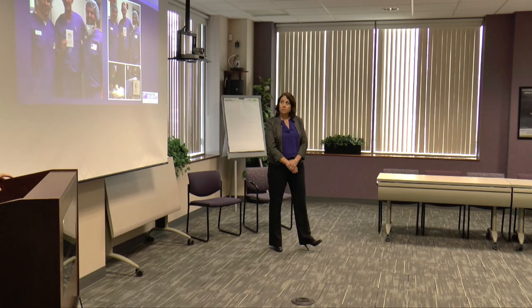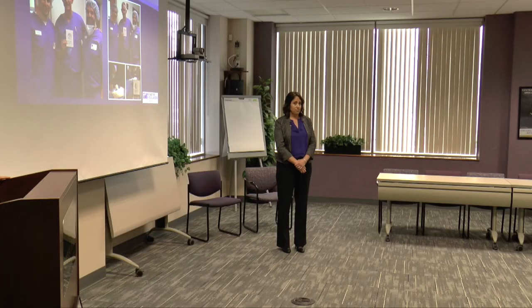When you try to correct a mild astigmatism with the laser, does that change the shape of the eye a little bit? Yes, it does. That's exactly correct, because that's on the corneal surface. And you say that's pretty successful? That's very successful. I use that typically for lesser amounts of astigmatism, usually between 1/2 and say 1 to 1 1/4 units of astigmatism. And we really like the toric lenses for over a diopter.